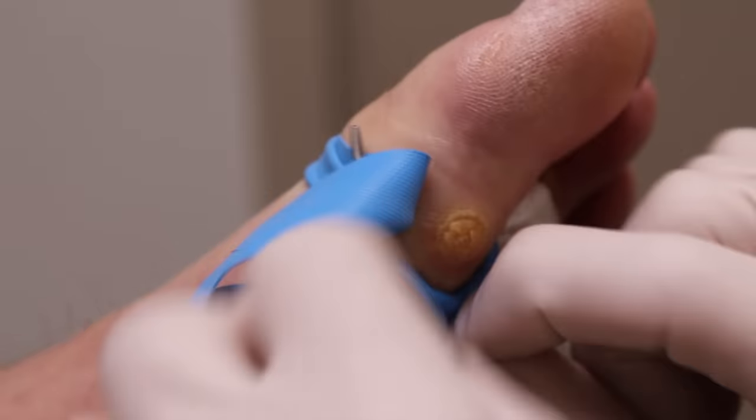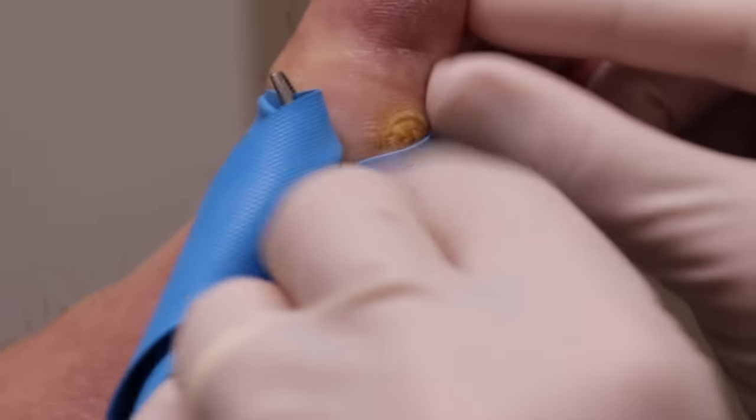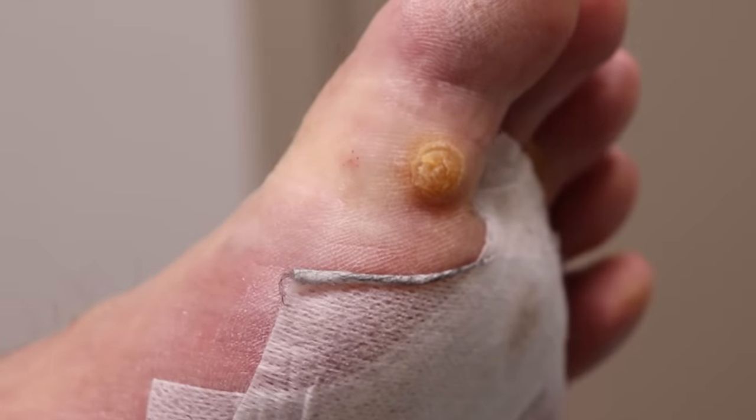It's kind of blocking a little bit. I'll see if I can work around it. Saving the best for last today, huh?